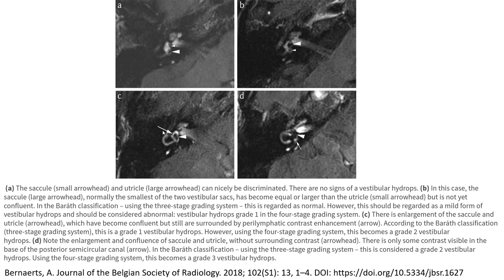In image A, the saccule (small arrowhead) and utricle (large arrowhead) can nicely be discriminated with no signs of vestibular hydrops. In image B, the saccule, normally the smallest of the two vestibular structures, has become equal or larger than the utricle, small arrowhead indicated, but it is not confluent. In the Gibson classification using the three-state grading system, it is regarded as normal; however, this could be regarded as a mild form of vestibular hydrops and should be considered abnormal — vestibular hydrops grade 1 in the older grading system.